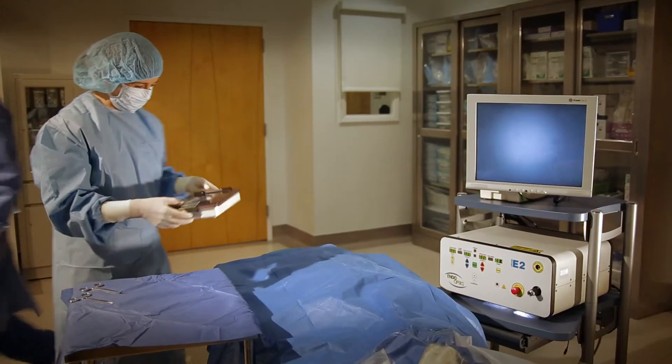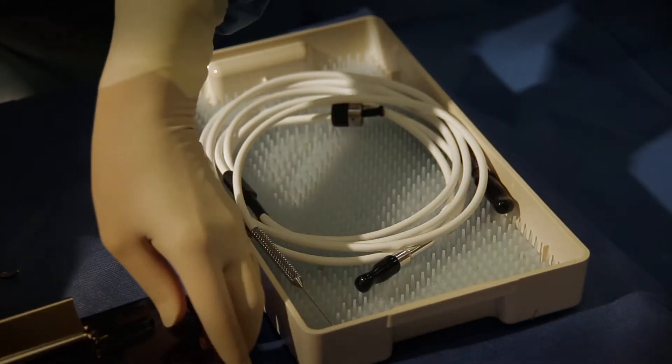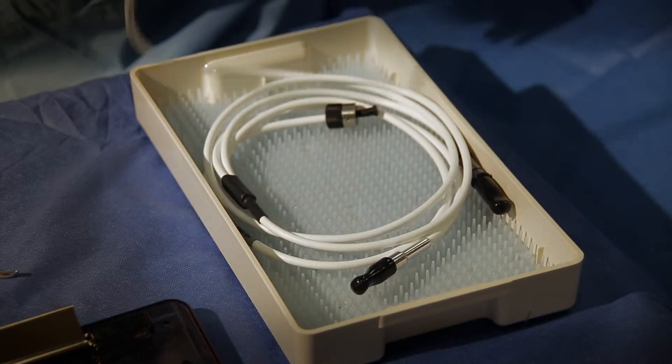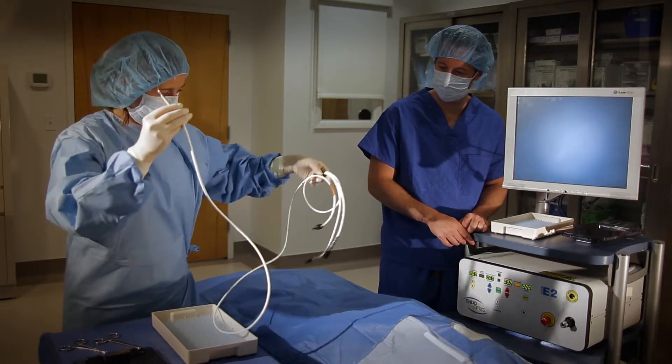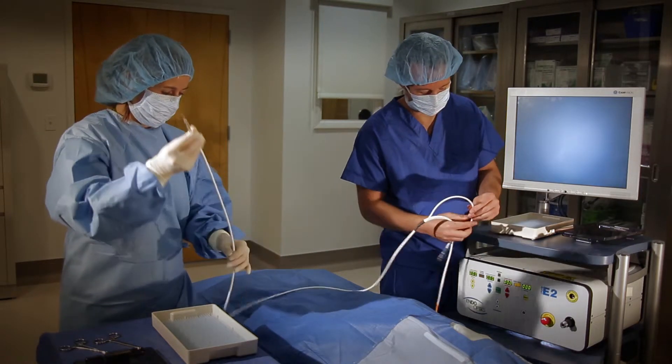At surgery time, the sterilized endoscope is handed into the sterile field. If it was coiled into place properly, the scrub nurse should be able to lift the tip with one hand and raise the endoscope out of the tray without bending it. The capped connector ends are passed to the circulating nurse near the unit.